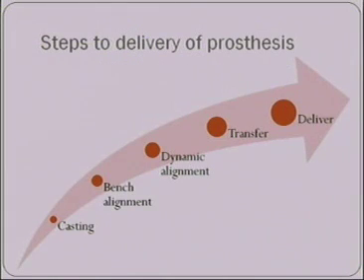So now I kind of want to give you just an overview of the entire process from casting to delivery, to see where dynamic alignment and bench alignment and the transfer process fit in. There are a couple of good videos that you can watch. There's going to be one at the end that basically, real quickly, goes through bench alignment, dynamic alignment, and then the transfer process.